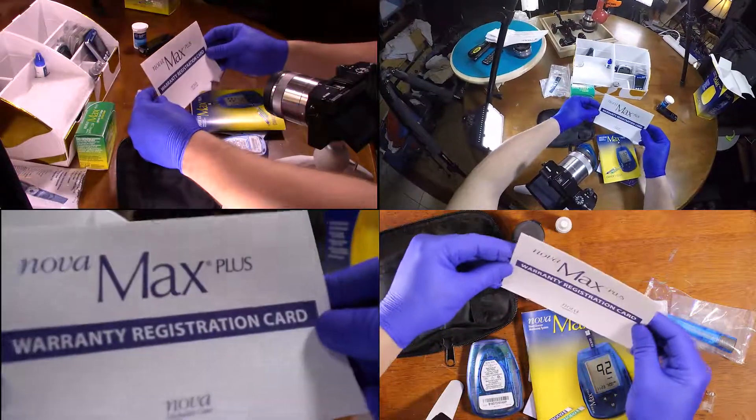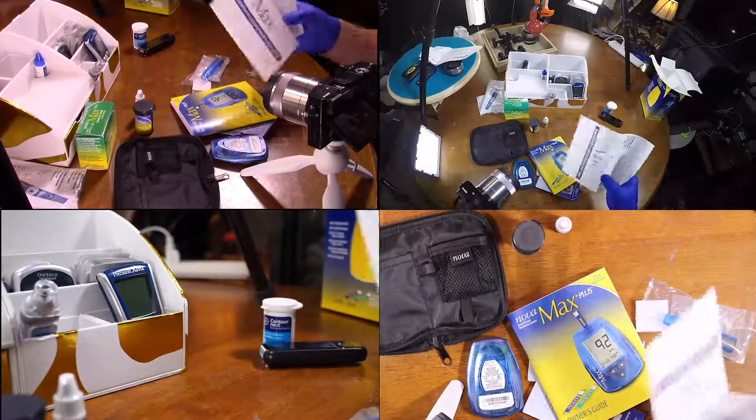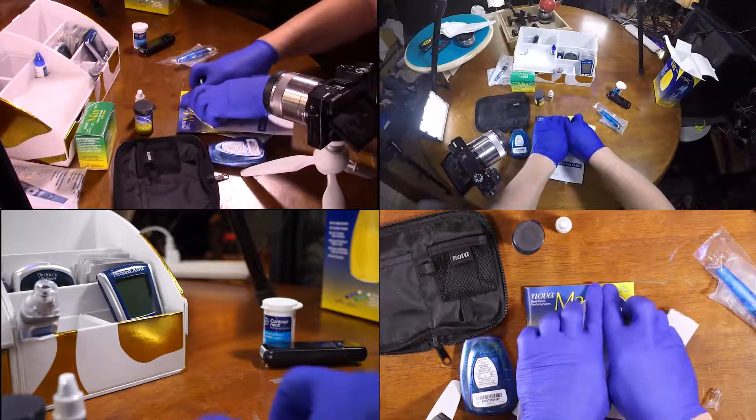A warranty — though I didn't spend much money, so I don't really care about a warranty. With this, it's very important to go ahead and fold these edges for the warranty to take effect.